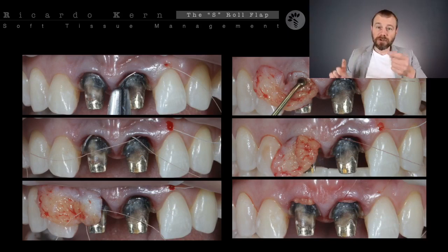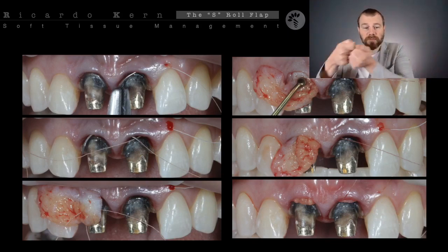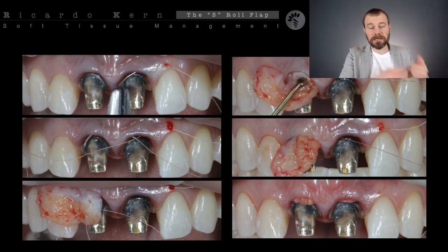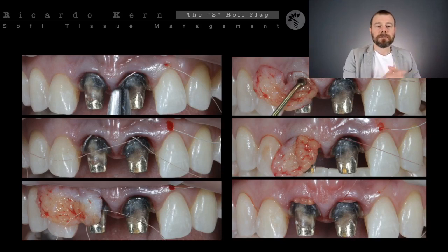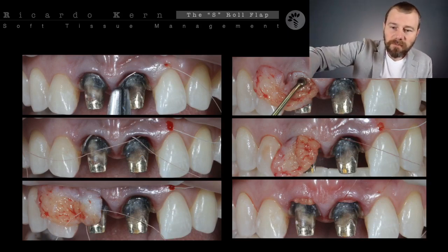Why is that? To not engage and pinch anything in the middle, not to engage periosteum or connective tissue, because if you engage something on the way from one tooth to the other, what happens when you try to bring the connective tissue? Of course, the connective tissue is just going to get stuck in the middle of the way. Now it's time for us to bring the connective tissue into place, okay?